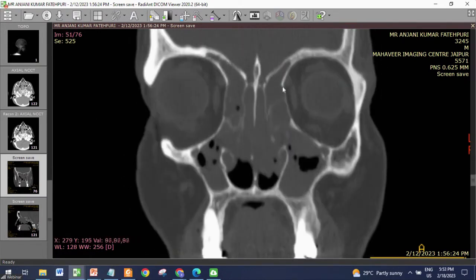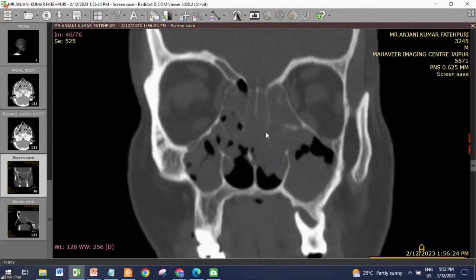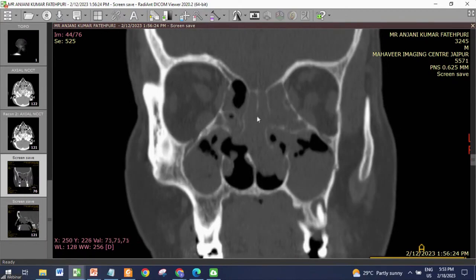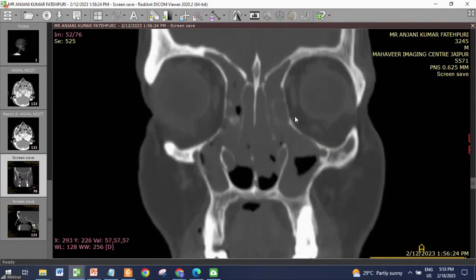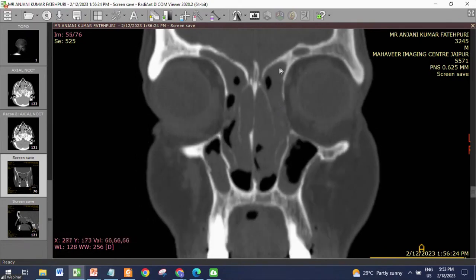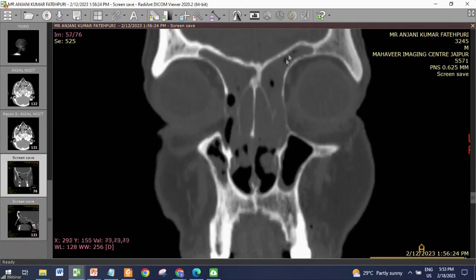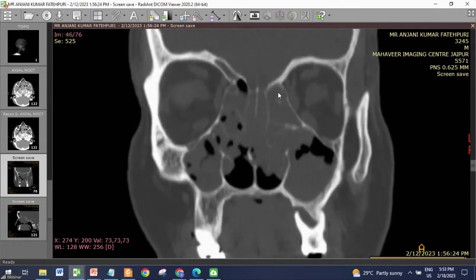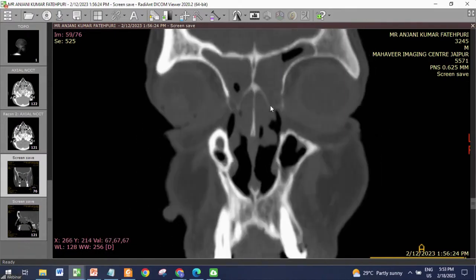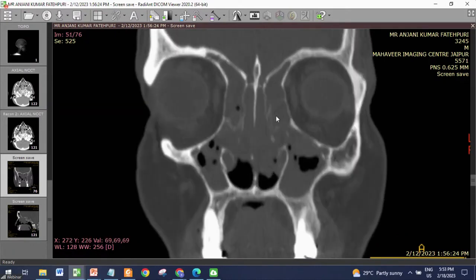Level of the orbit and the medial wall of the maxilla. Good. Some septal deviation on this side you can see. See this? Will require a limited septoplasty like the previous case. These are all ethmoidal cells, anterior ethmoidal cells. Little bit of the supraorbital recess like this. Not like the first case who had a big supraorbital recess, but it is a shallow supraorbital recess. And the frontal, the big frontals. And this. So let's quickly.